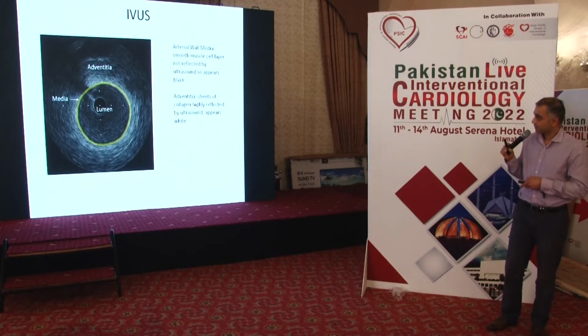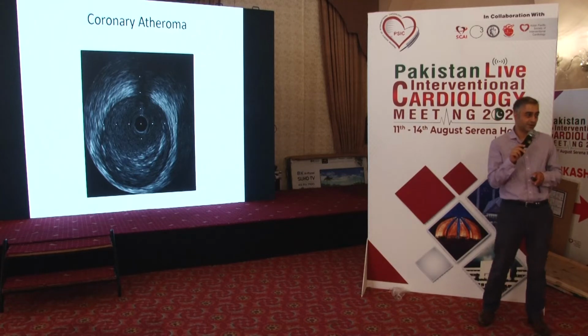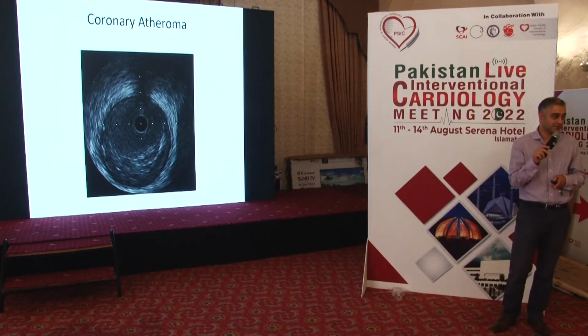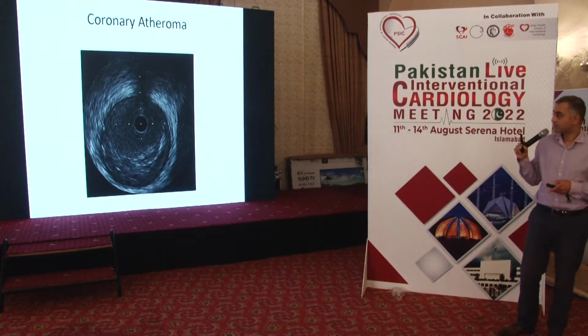Okay. Next slide, please. So, of course, very rare for you to put an IVUS catheter down and find a normal coronary artery. What you will normally find is disease in the vessel, because you wouldn't be doing the IVUS in the first place. So here, next slide, please.